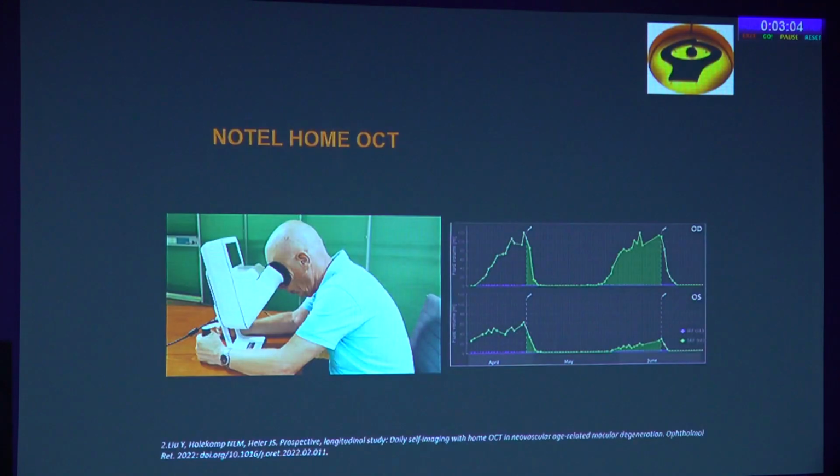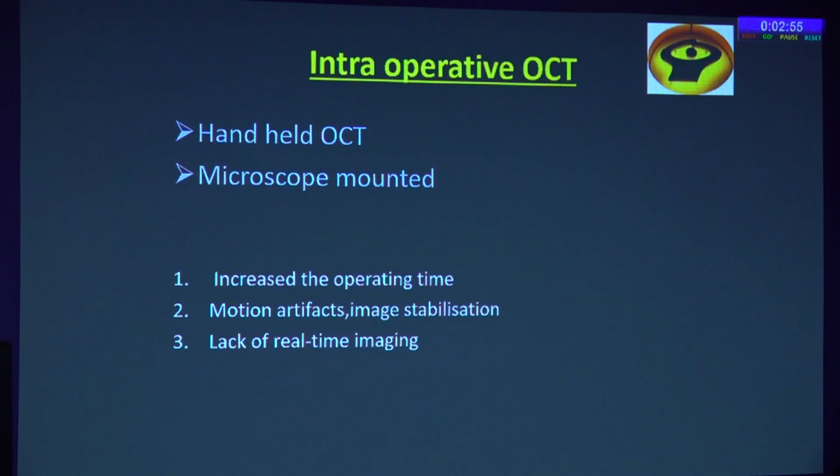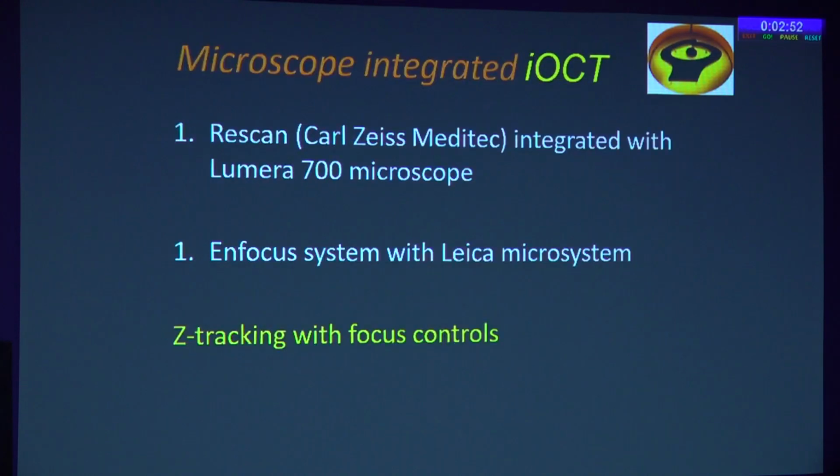They have a software called NOVA, the Notal OCT Analyzer, which can show the presence of intraretinal or subretinal fluid, mainly used in AMD patients. And because intraoperative OCT has already been covered by Adit, I'll just skip this one.